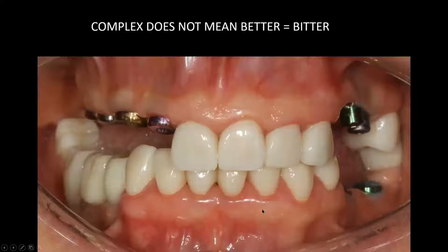Now, what about this patient, Stan, where you can see the implants are placed to restore. We have 4 implants on the right. And if you look very carefully, the whole mouth is reconstructed. When the patient presented to me, she had a temporary bridge work that she couldn't accustom to. She'd been walking around like this for almost 6 months and can't get used to the bridge, the permanent bridge, sorry, the permanent bridge. Where do we go from here?